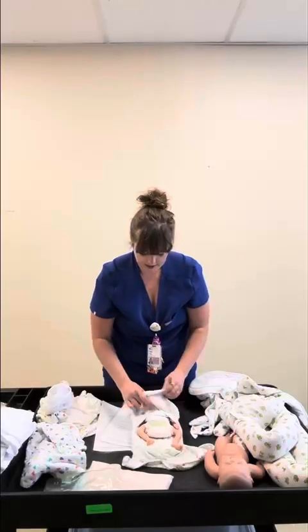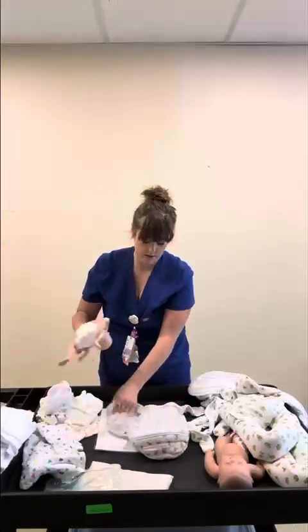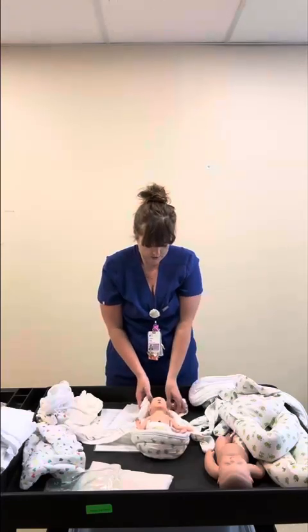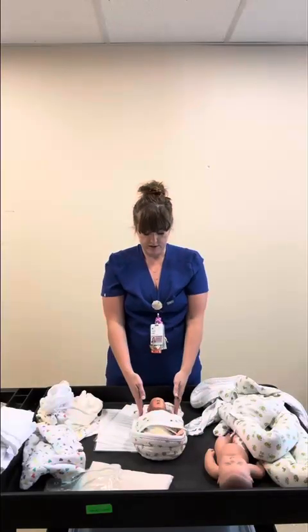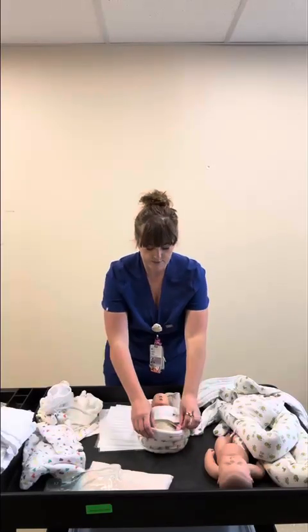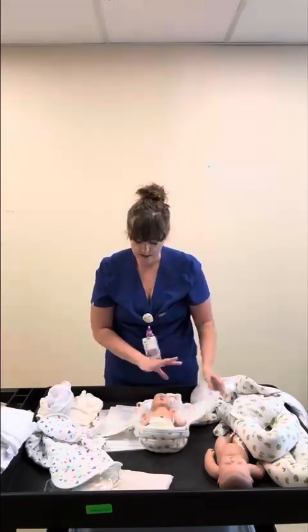Another way you can modify it is to kind of make it a snuggle up. So turn it completely around, and then this is gonna act like the foot zone, like the snuggle up does. And then this little headpiece is just gonna be not used. You're gonna kind of tuck it underneath. And then the straps actually fit really nicely in this position. You can also utilize another froggy or some type of blanket roll to create that 360. But you can see this mimics more of a swaddle up, snuggle up, where the foot is where this piece is. So feel free to get creative as long as you're being able to visualize the baby, their devices, and the temp probe's not covered.